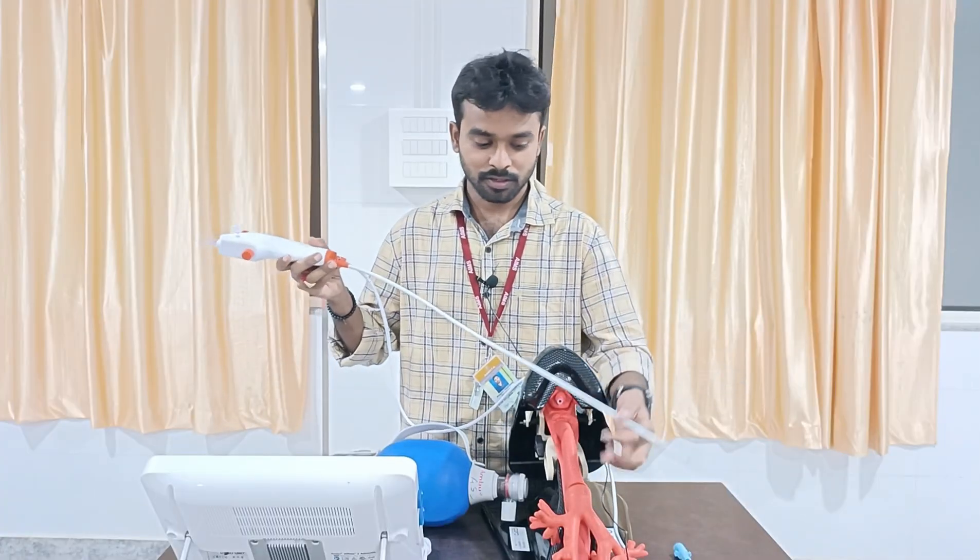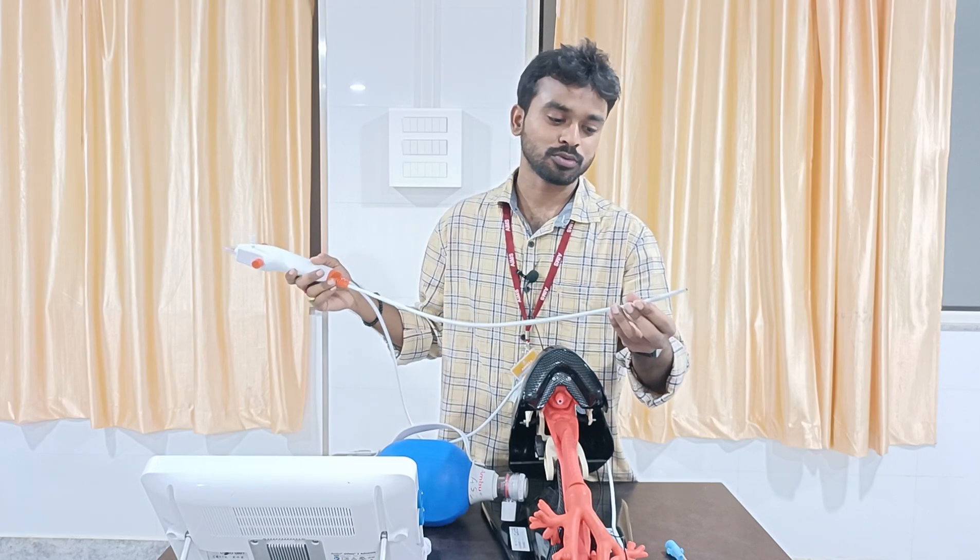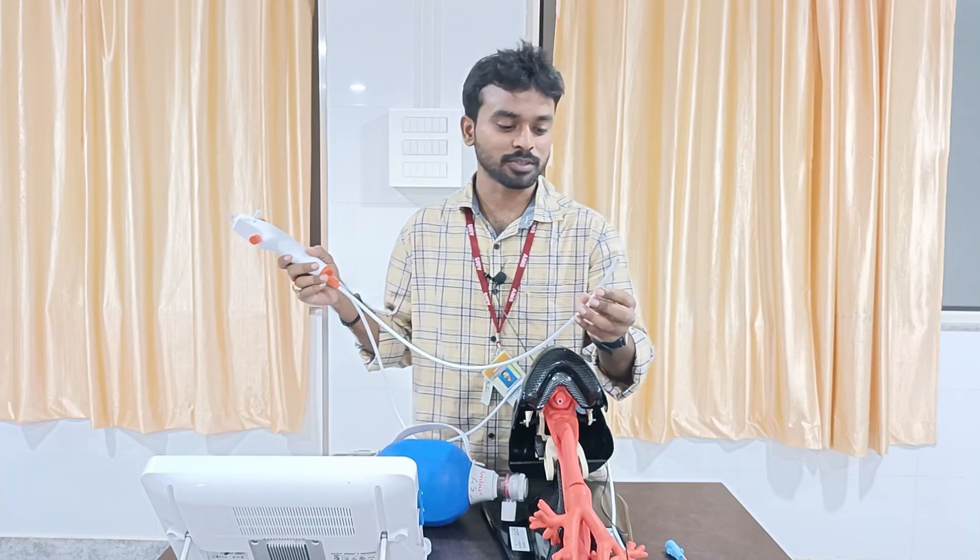Welcome to ATCM, the emergency medicine channel. Today I have with me the flexible bronchoscope. First, let's see the parts of this flexible bronchoscope.